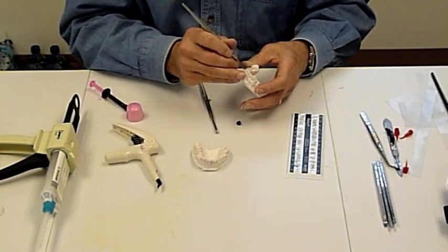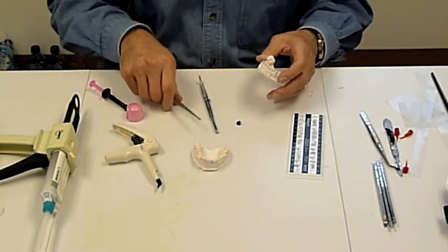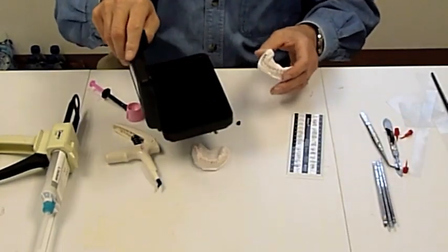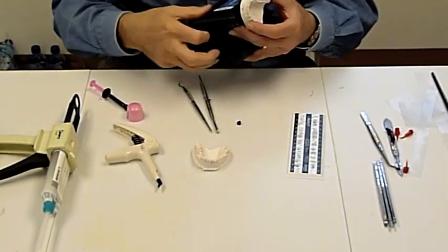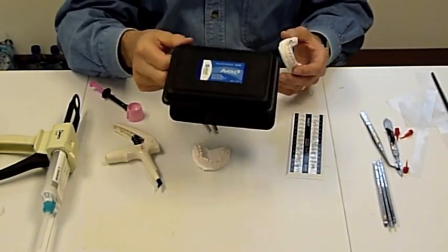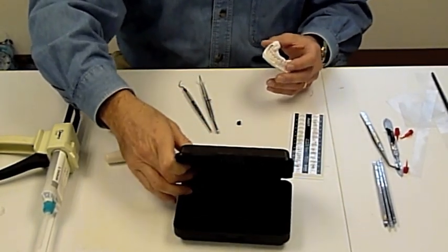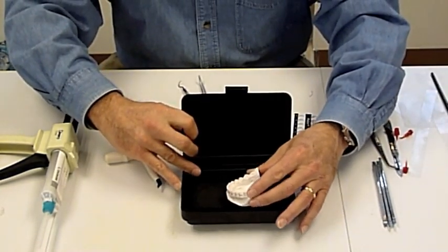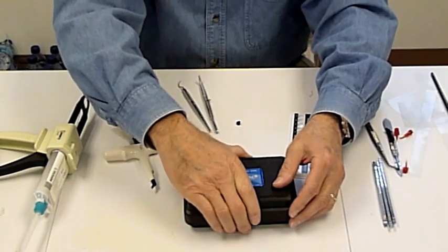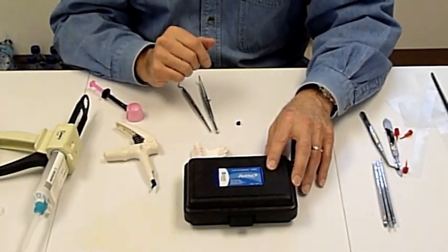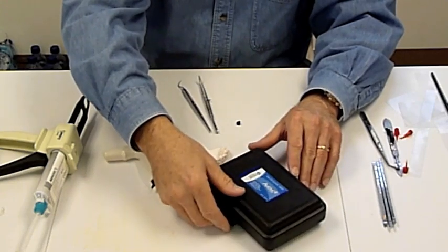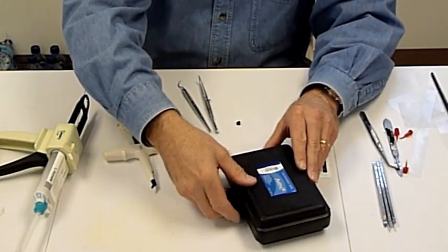When the staff have questions about where the bracket should be, they'll often use the little black box that we have here, courtesy of Opal. Any of your doctors can get these from Opal by ordering enough CXI or MX brackets. The staff will put it in there, it's light tight, the brackets won't set up, I can adjust them, and then the staff is able to go ahead and cure them to the model.